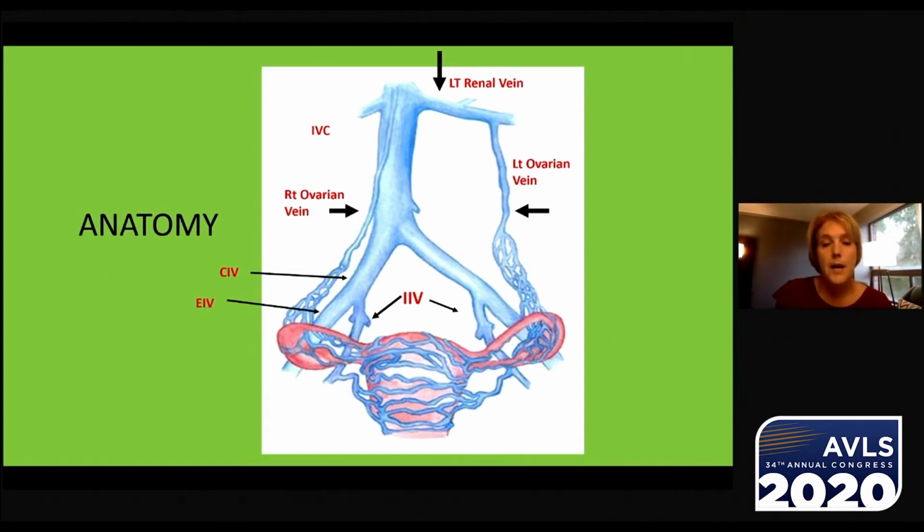So we're moving up now, we're going to take a peek at our ovarian veins. You can notice that as they originate down at the ovaries, we're going to see multiple branches and multiple trunks. And as you move up the abdomen, we're going to notice that they join to become one trunk. Sometimes it's two, sometimes even three, but typically we can identify at least one of these trunks. And that gets larger, so we can see it easier. You can do that right around the umbilicus, or the belly button, is where you're going to start to notice that all those little trunks come together.